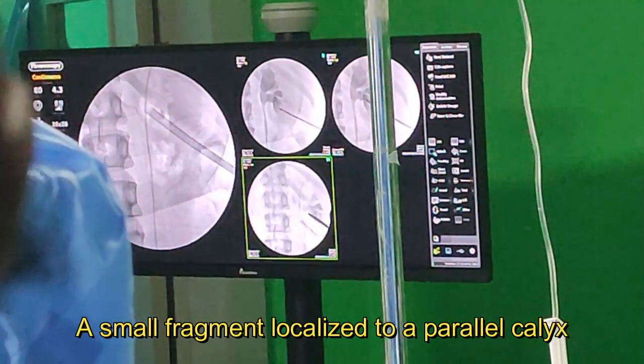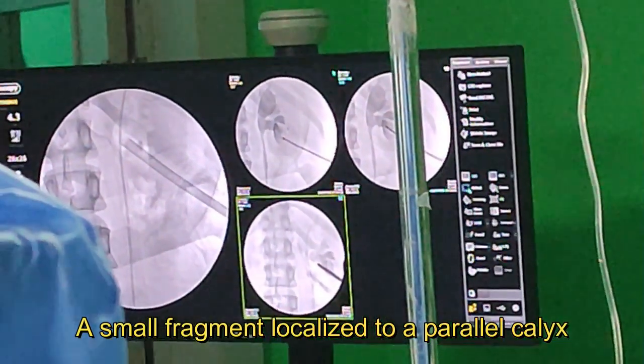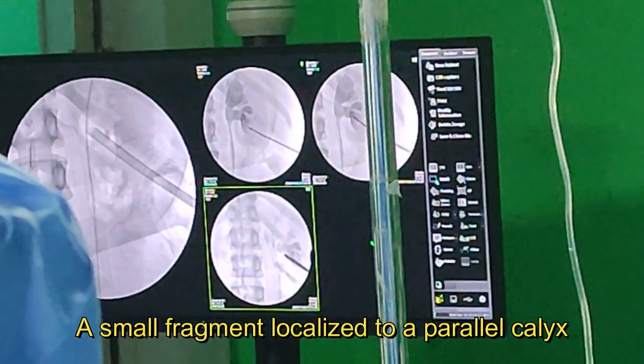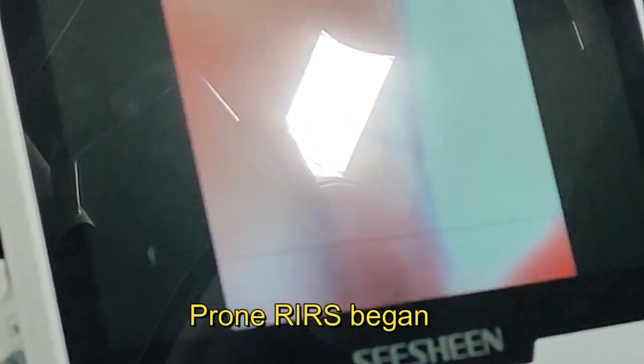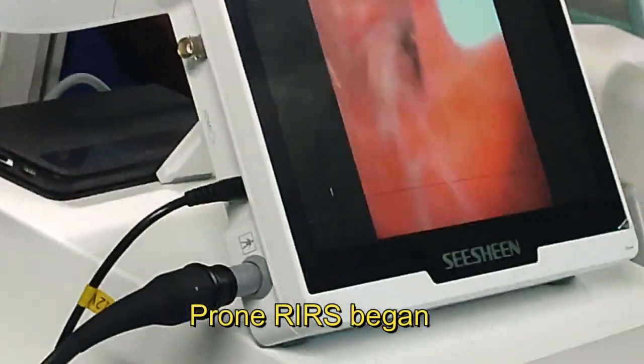It remains a tiny one there. Can you see? Yes, just above my little gauge. So let me demonstrate. They started here. Can you move closer? Yes. Can you come back? See, that's... Can you give my camera flat so that you can show them? That's my camera suspension.